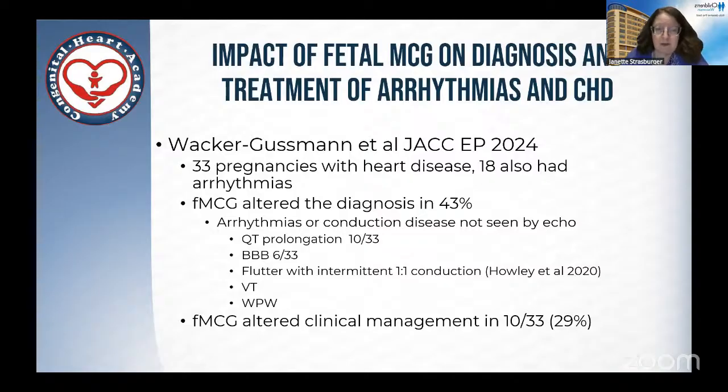Bundle branch block, I'll show you more about later. Flutter with intermittent 1-to-1 conduction, VT, WPW. So FMCG altered the clinical management in 10 of the 33 cases.